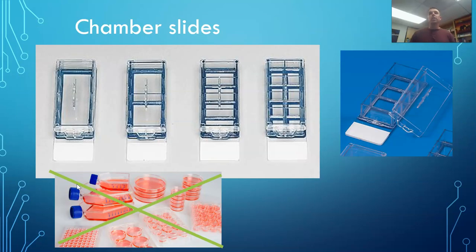All right, so one of the things we are going to do this week, because you have to do this over the week in preparation for next week, is to create cell chamber slides. So when we're growing cells in our flasks here, we actually can't use this on a fluorescent microscope or a bright light microscope, only a phase contrast scope that lets us tell if the cells are alive or not. In order to really study those cells by staining them or using fluorescence microscopy, all those things we might want to do with them later on, we have to get them onto a chamber slide. So basically, this chamber slide is almost like a cell culture chamber, but on a glass slide.